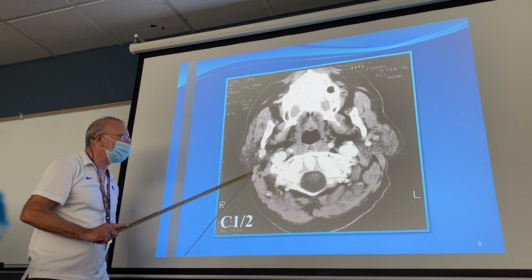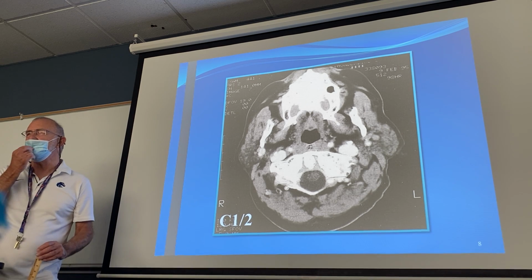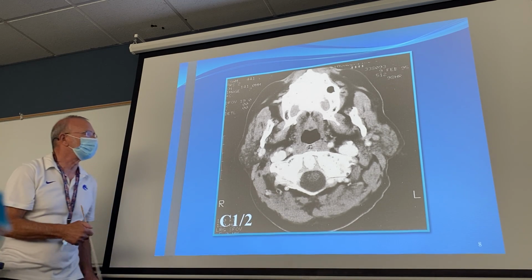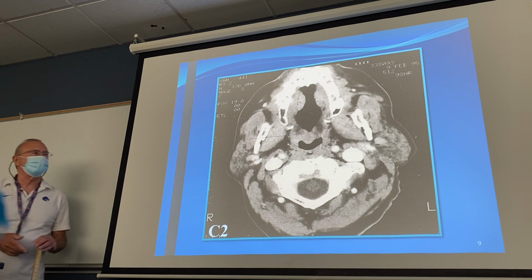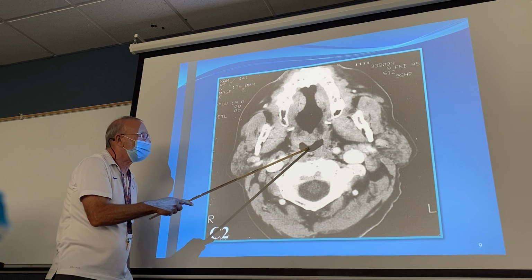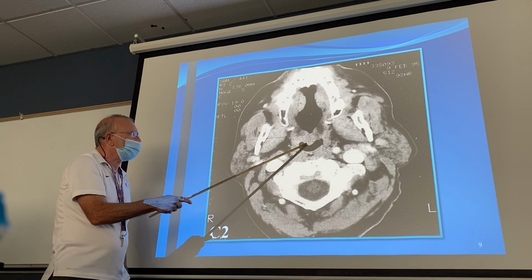Here, this little sliver of muscle over here will be important because it helps us to find compartments in the neck, which is the SCM. Okay, the little trapezius back over here. Just getting into the good stuff. All right, nasopharynx anterior. From our perspective, posterior, little early signs of oropharynx and early transition of uvula.